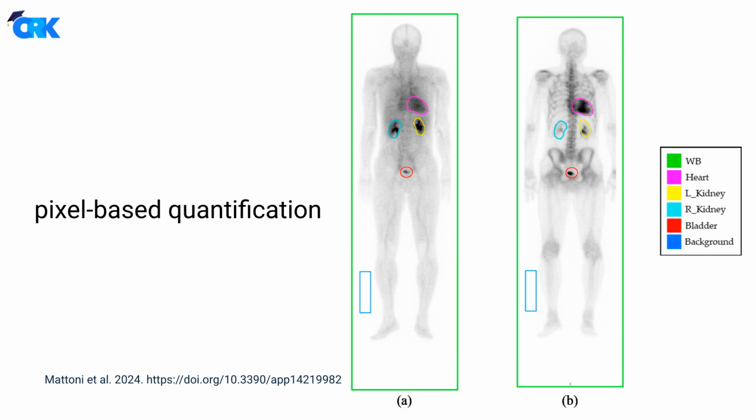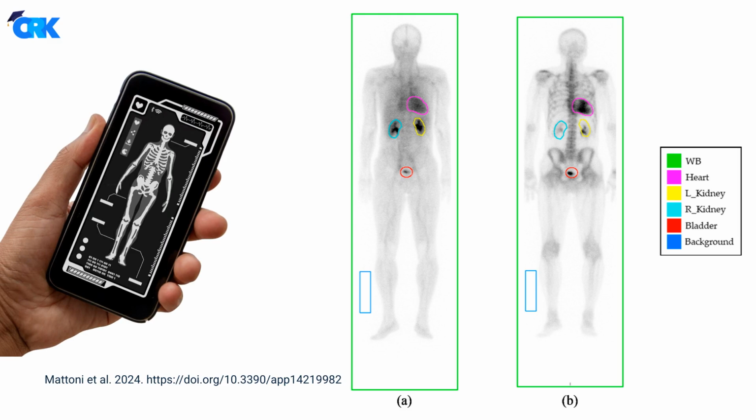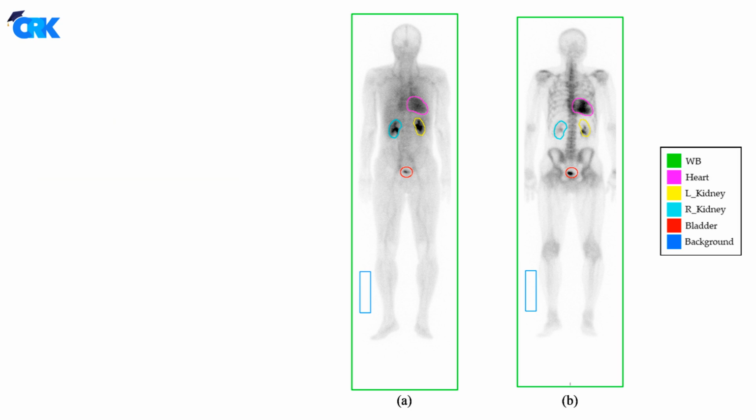Here, we're not just visually estimating uptake or comparing regions. We're using software to measure exact values, providing objective, reproducible data to support or clarify visual findings. Specifically, 3 key metrics are evaluated.